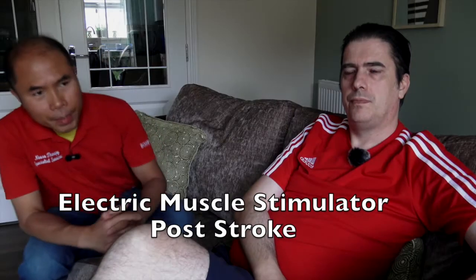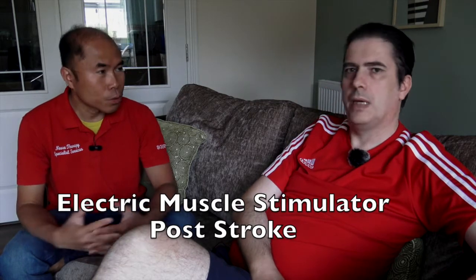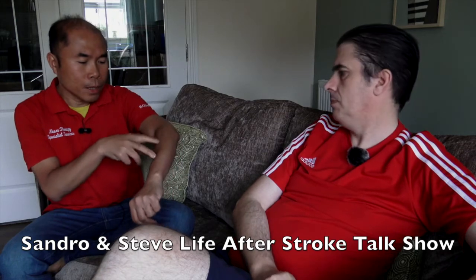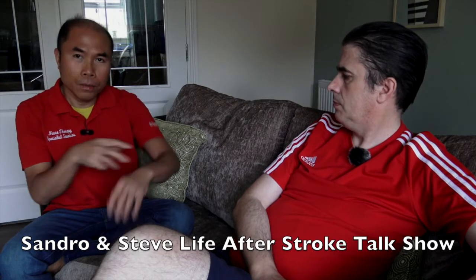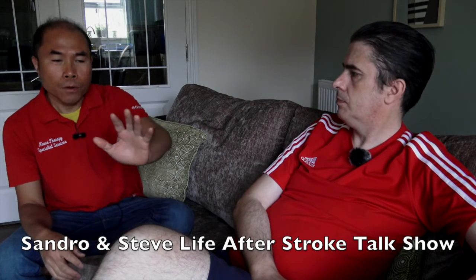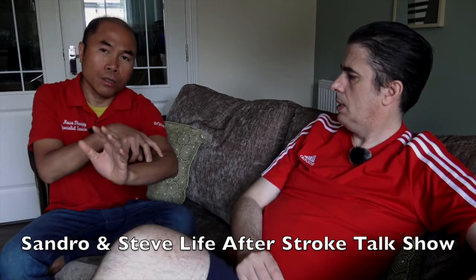So basically, electric muscle stimulator is a form of modality to help you relearn muscle contraction, muscle control for a particular muscle group which you have difficulty controlling after your stroke. So basically, two electrodes are placed in one muscle group, let's say a wrist extensor, for example. The electrodes will send electrical signal to the muscle, and the muscle will contract. And then when the muscle contracts, of course, your wrist will lift like that. And then you can relearn how to lift your wrist by contracting the extensors of the wrist.